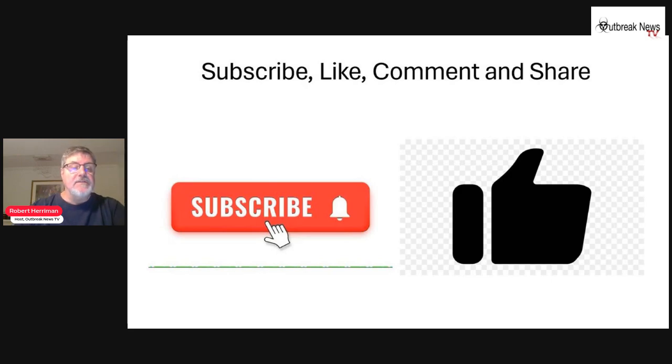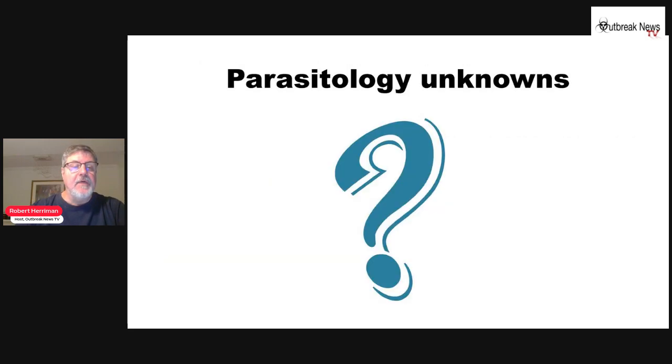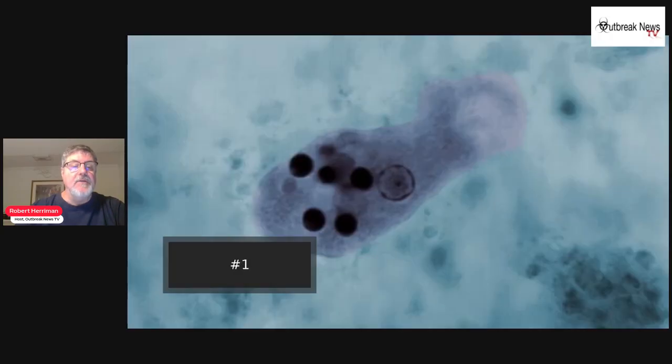All right, so let's go ahead and get started with Parasitology Unknowns. And number one, I'll go ahead and give a description. This stage of the parasite has a single nucleus, which has a centrally placed karyosome and uniformly distributed peripheral chromatin. The cytoplasm has a granular or ground glass appearance, and oftentimes you may see ingested RBCs. What do you think? I'll give you a few seconds.